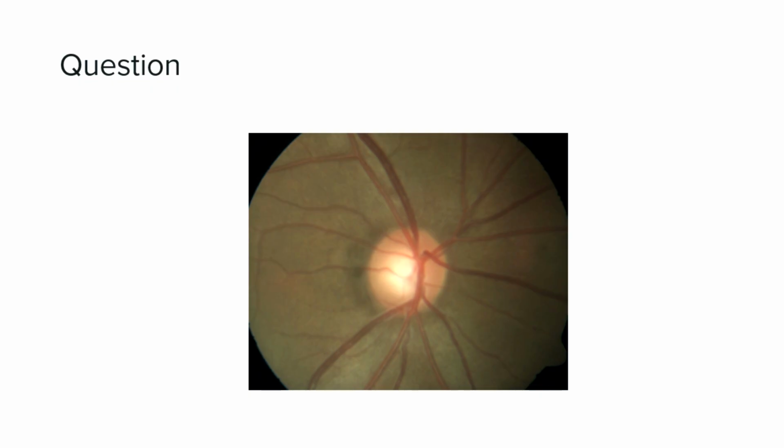There is peripapillary atrophy without any RNFLD and without any disc hemorrhages. The vertical cup disc ratio is 0.6. Thank you.